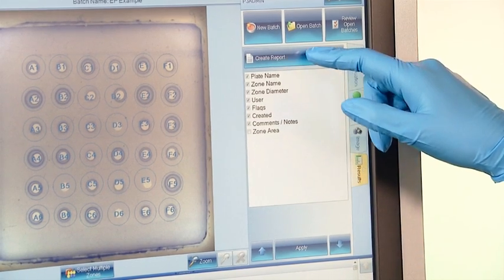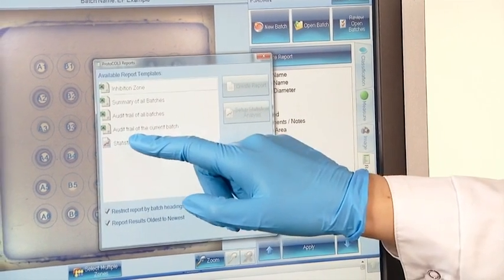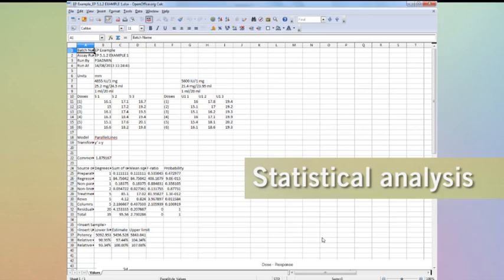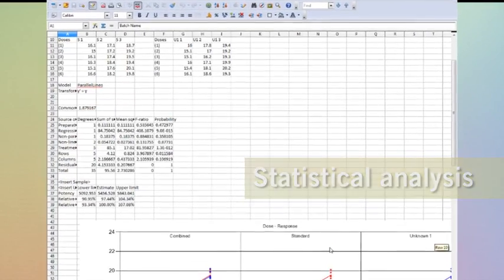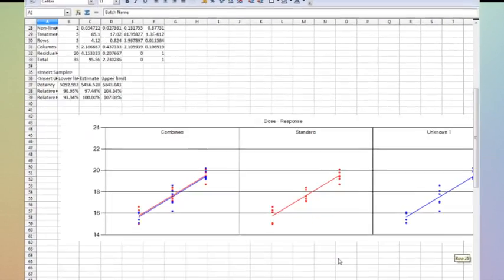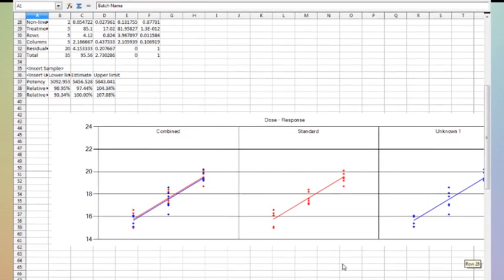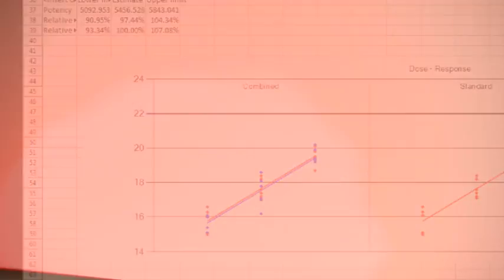Another useful function of the Protocol 3 is the integrated statistical analysis package. Vaccine and antibiotic potencies can be calculated accurately from the zone measurements at the touch of a button.